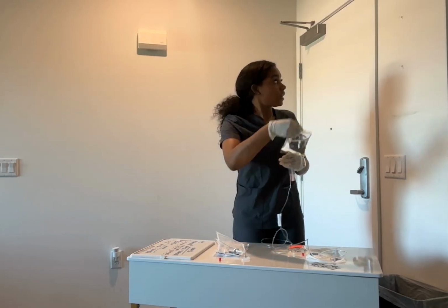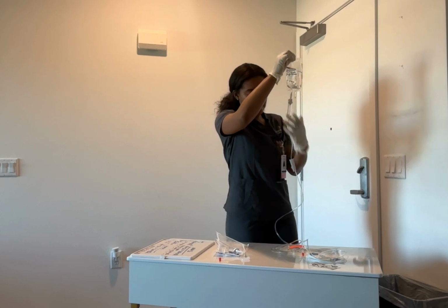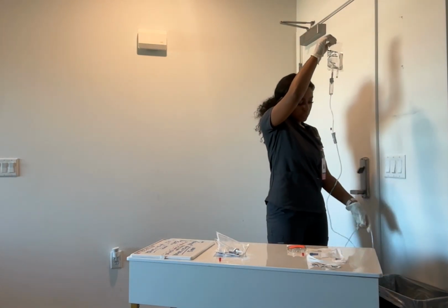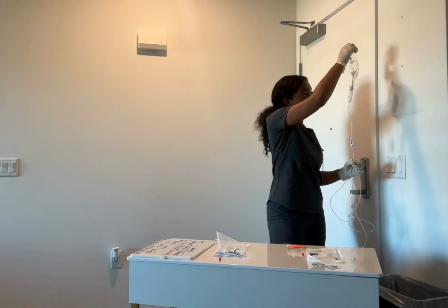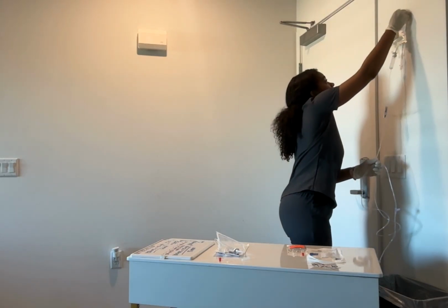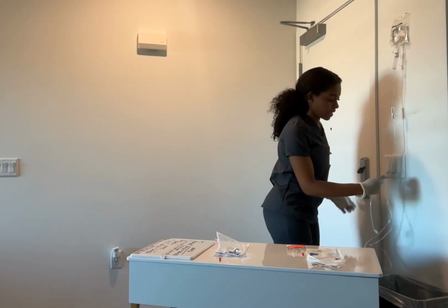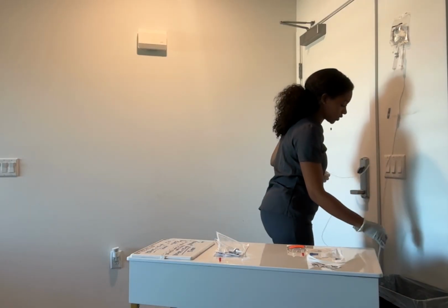Perfect. And I'm going to hang this IV fluid up. I'm going to make sure these drips are right here. Make sure it goes out so I don't get any water.